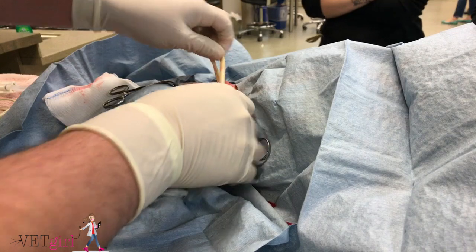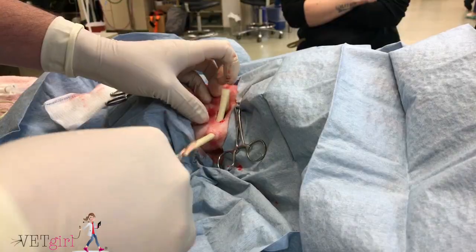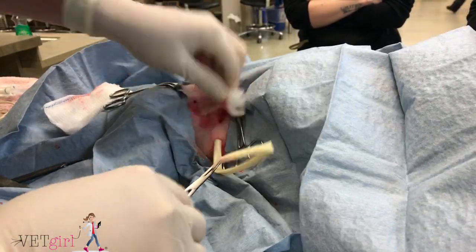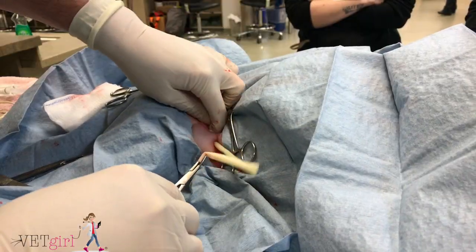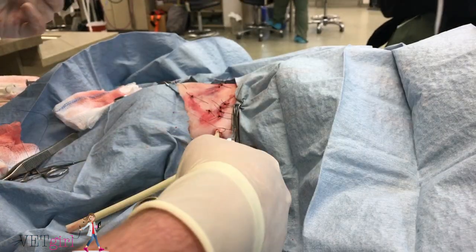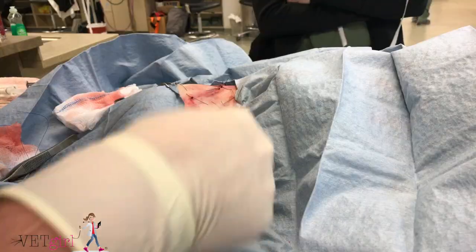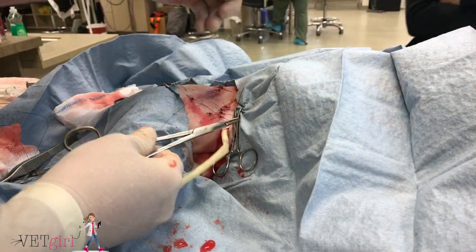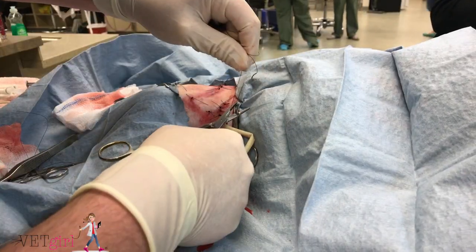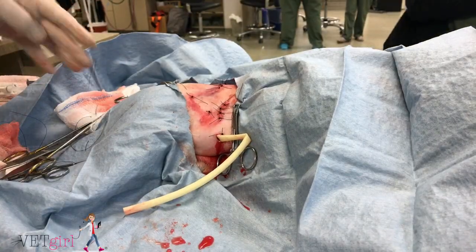For demonstration purposes and visualization only, initially the drain was coursed on the outside of the patient. Of course, the proper placement of the drain is underneath the skin, which the video now demonstrates. Once the drain is placed through the stab incision at the ventral aspect of the wound, the drain is then cut in a diagonal manner to allow for better fluid flow, and the drain is tacked ventrally followed by final wound closure.